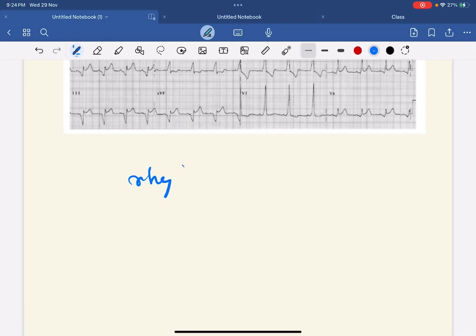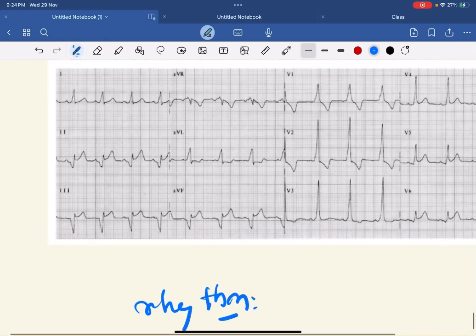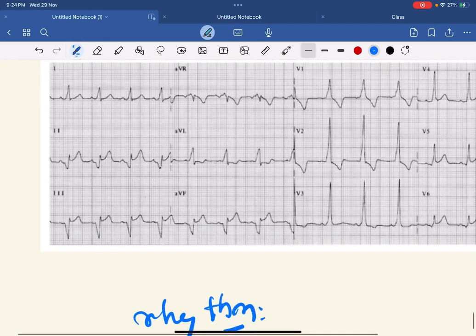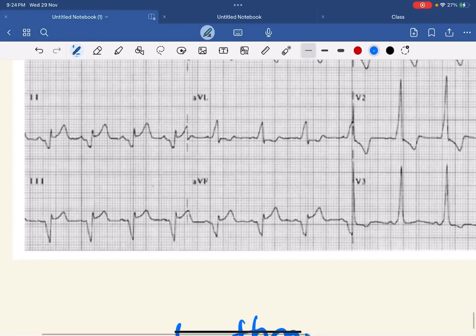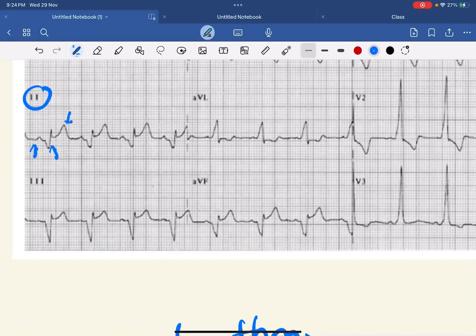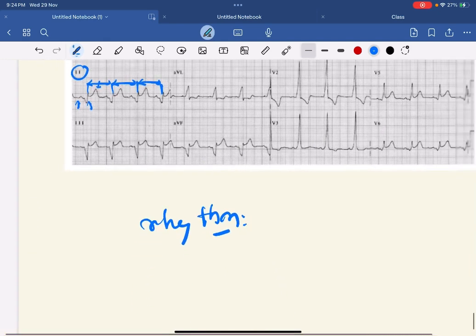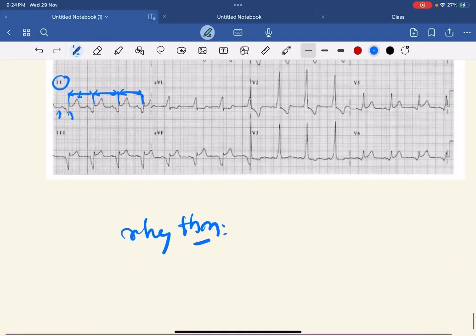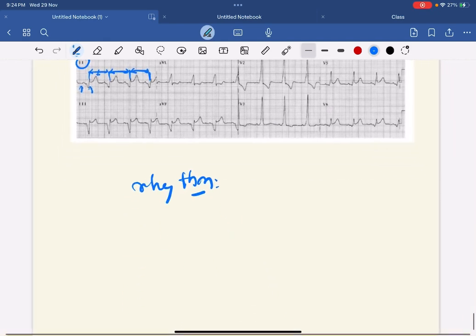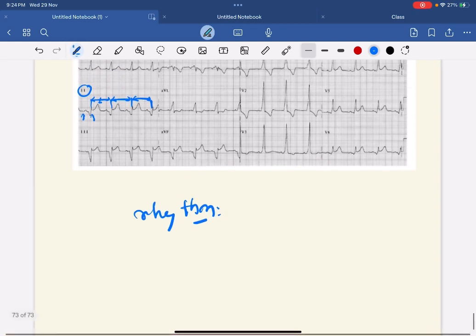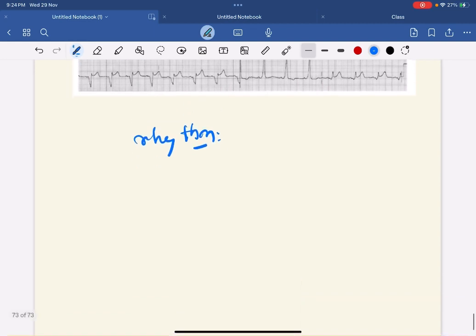Let's see the rhythm of the ECG. For that you have to see lead II. There are P waves, QRS complexes, and T waves. Every P wave is followed by QRS and the RR interval looks fairly regular. All the P waves are looking normal and similar, so it is in normal sinus rhythm.